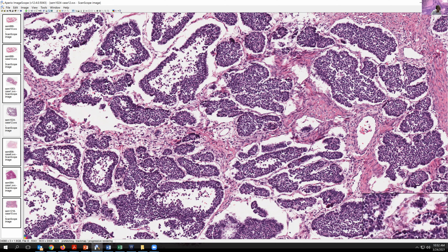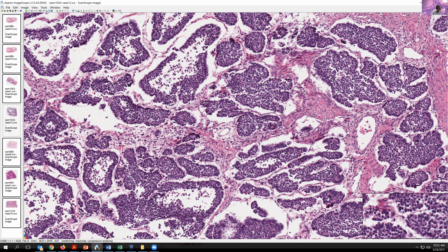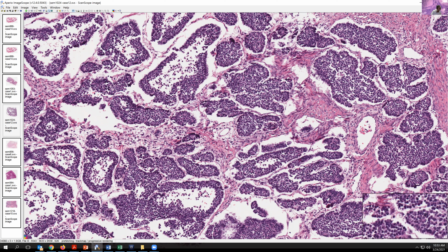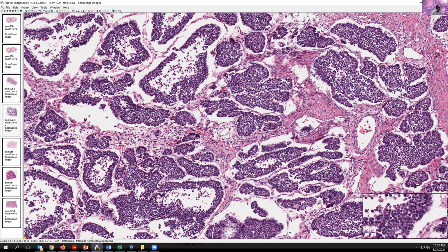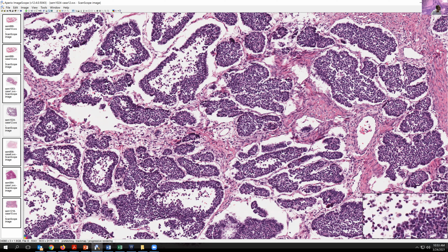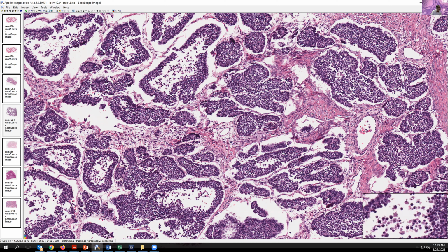Now, there's not a particularly good way to distinguish that aside from clinical history or clinical findings, which in this case were remarkable for an appendiceal neuroendocrine carcinoma, actually a mixed neuroendocrine adenocarcinoma. But in this case, only the neuroendocrine component had metastasized, and here in the ovary was forming this somewhat pseudofollicular pattern with areas of insular morphology.